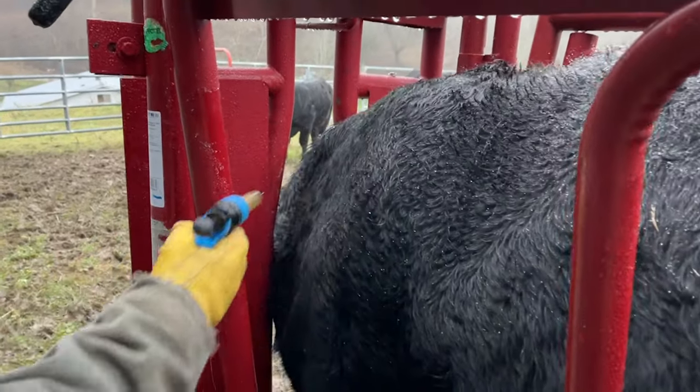Now, if you notice on this cow, her heat patch is not rubbed, and you're probably wondering why we're breeding her. She should have come into heat by now, but since she hasn't, we've given her a shot of GnRH and we'll go ahead and breed her anyway. I'm going to leave this heat patch on to see if she comes back into heat on the next cycle. It's possible the CIDR was placed at a point in her cycle where it didn't make her come into heat. If she comes into heat a little later, we'll just go ahead and breed her again whenever that happens.